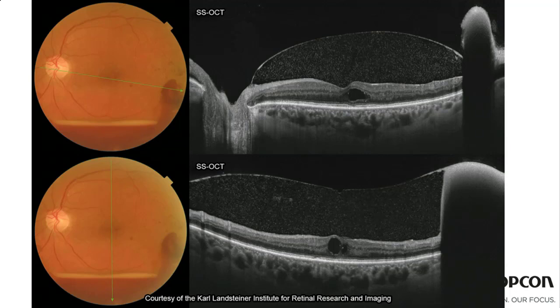So I took this one on the Triton, or on the swept source, put him in front of the machine, clicked once, he got up. It took less than a second for the entire scan.